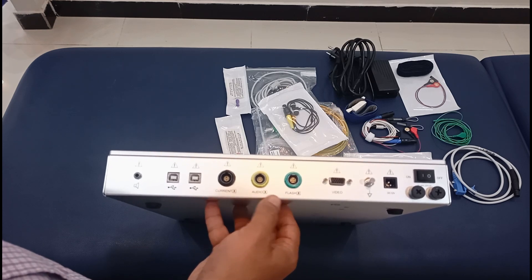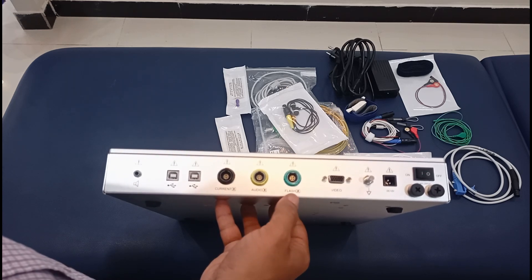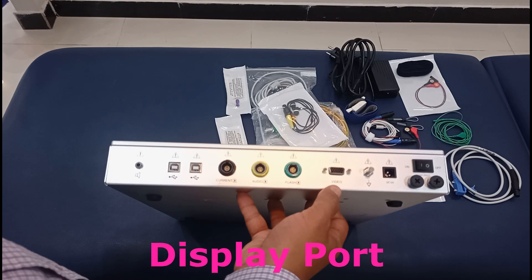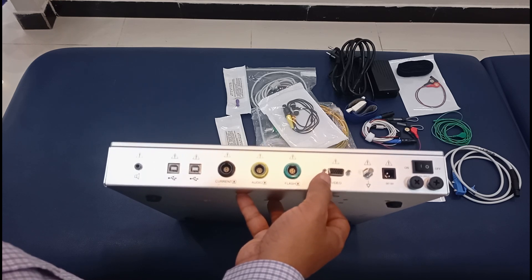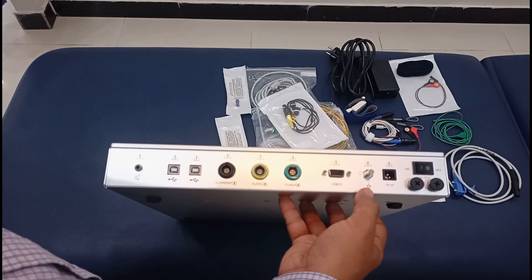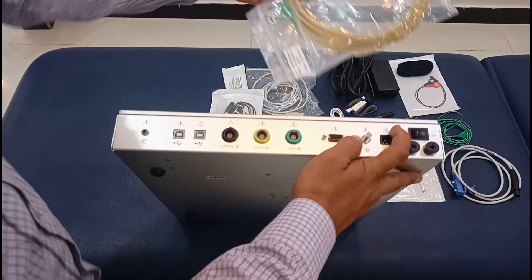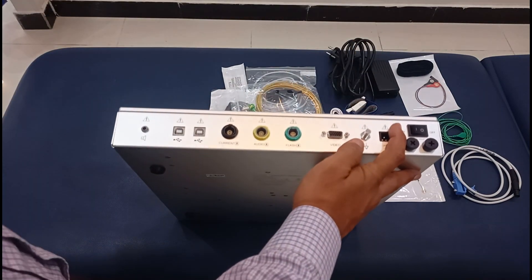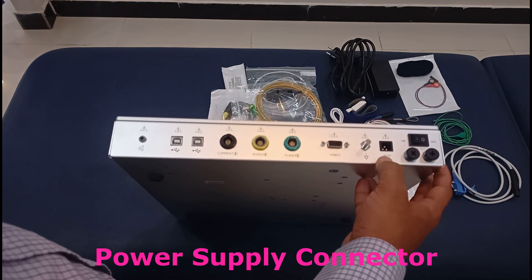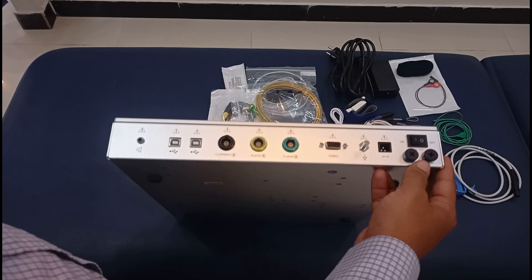This port is used to connect the earphones. The flash port is for the special goggle with many LEDs, which you connect there for the blink reflex assessment. This port is used to connect a monitor if you want to show the display externally. This is the main ground electrode — the bigger yellow and green wire. And this is the port for the power supply connection, along with the on/off switch and the two fuses.